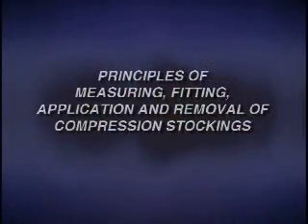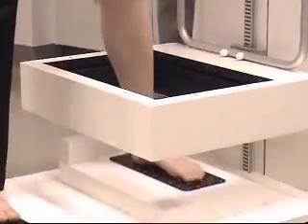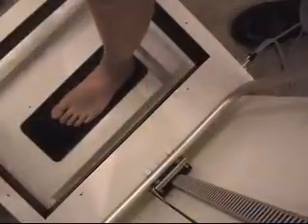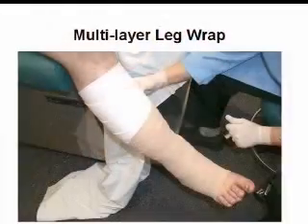One should attempt to measure for stockings in the morning when swelling is minimal. Both the circumference at the ankle and the widest part of the calf should be measured. The length for calf hose can be determined by measuring the distance between the heel and the popliteal fossa.